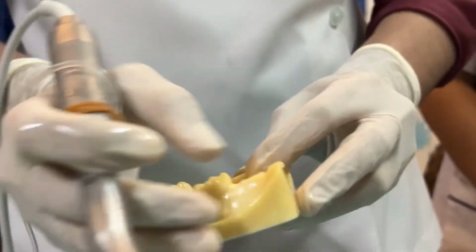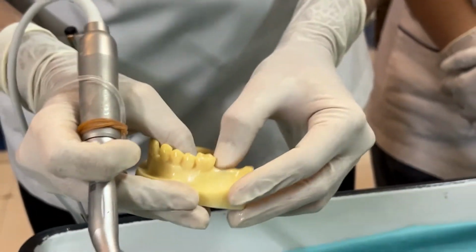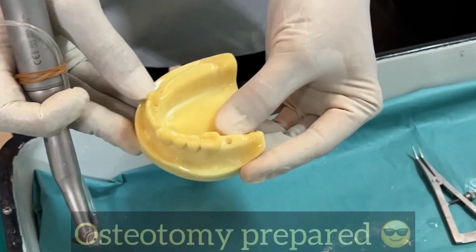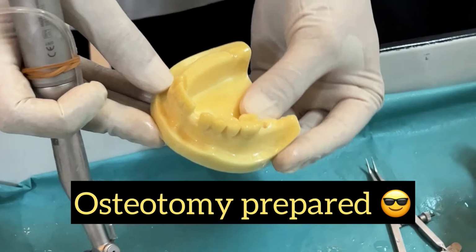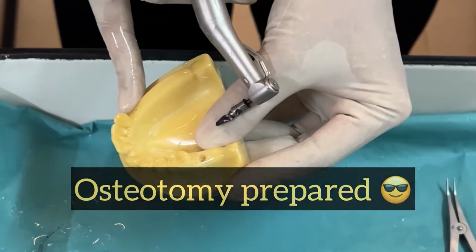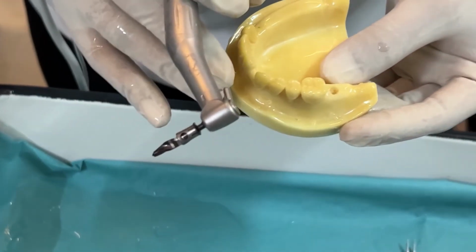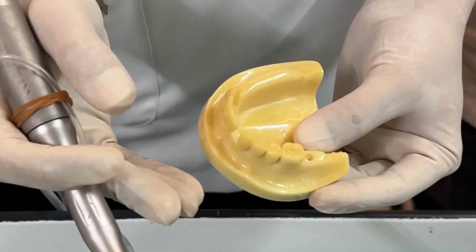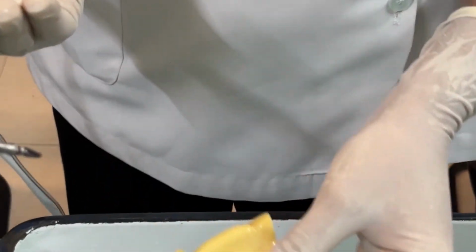So now my osteotomy is prepared. Slight water is there, but you are able to visualize as such. This is the osteotomy which has been prepared with ample distance from the adjacent tooth. So this osteotomy preparation is the key. The more you create it gently, atraumatically, more would be the survival of your implant.